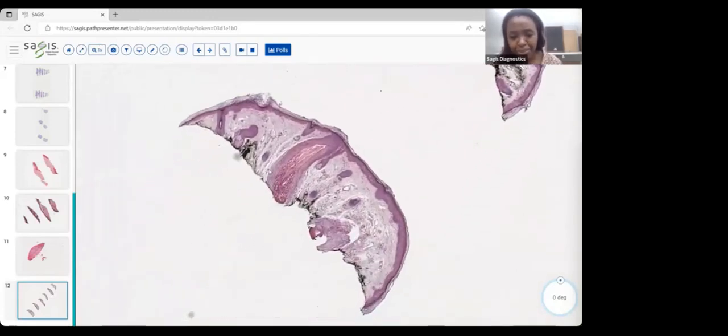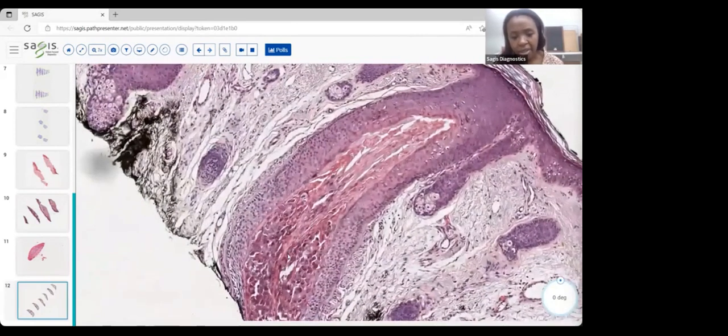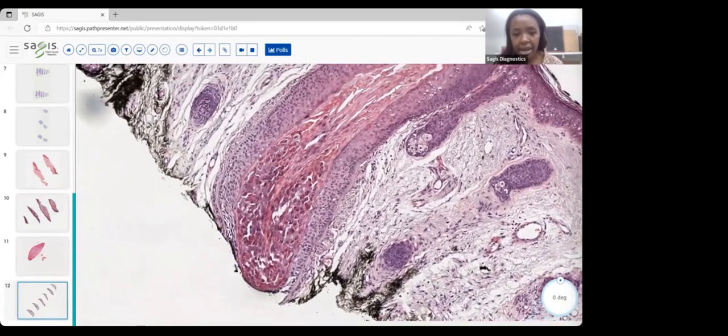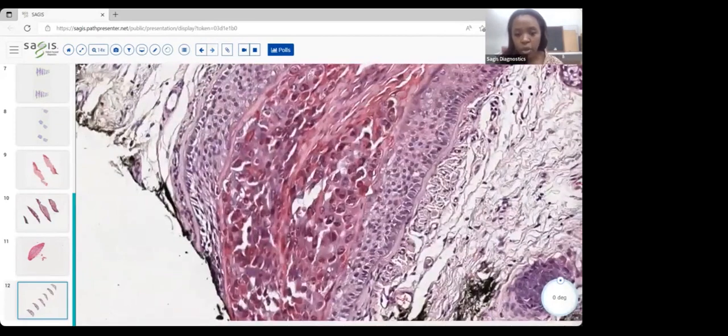Okay. All right. So, shooting right into the diagnosis, you just see this expansion of the hair. And look at those granules, those trichohyalin granules. They are just so many. This is not normal. This is atypical. This is something that you just do not see in a normal hair follicle. Look at those trichohyalin granules. It is chock-a-block full of them.